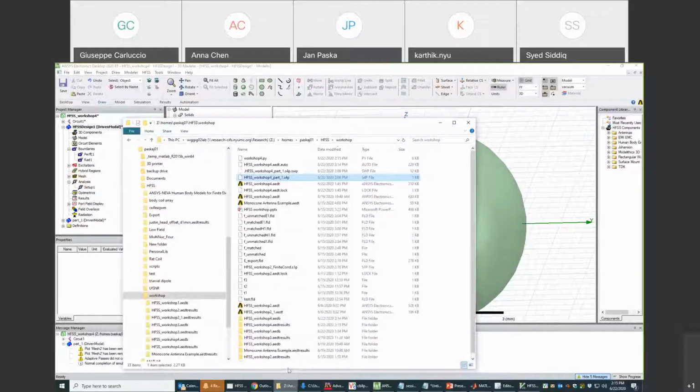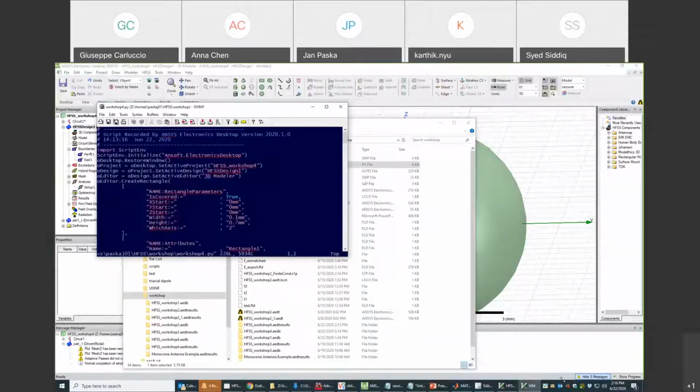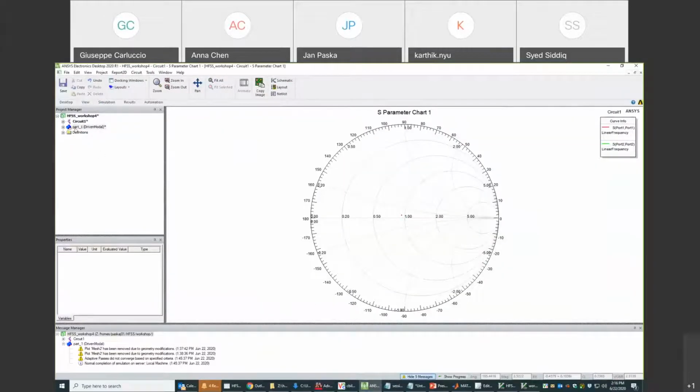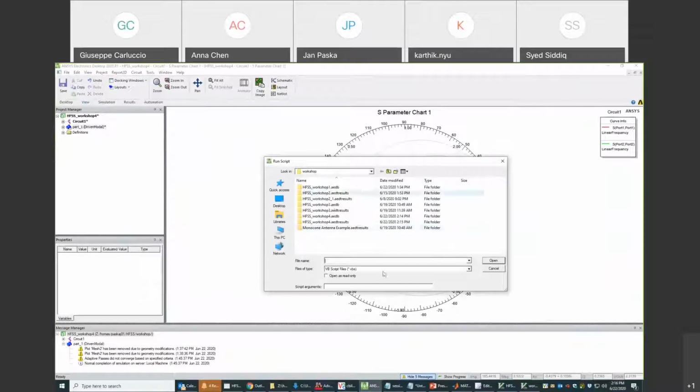And now let's go and have a look at the text file that we produced before. So all of what we did in generating this model is saved in this Python file. And that Python file we can just have a look at. And here we can see what it did. First, let's just test what it did. Let's delete this whole design. So now it's gone, and now we can say run script, and hopefully we need to select Python file because that's what we saved it in, because there are different script options.